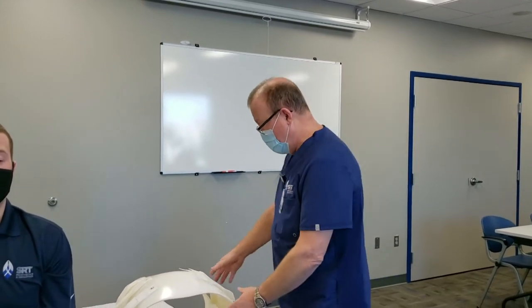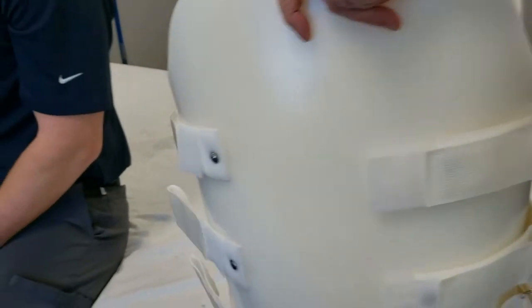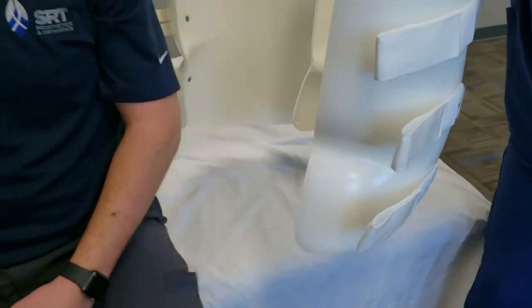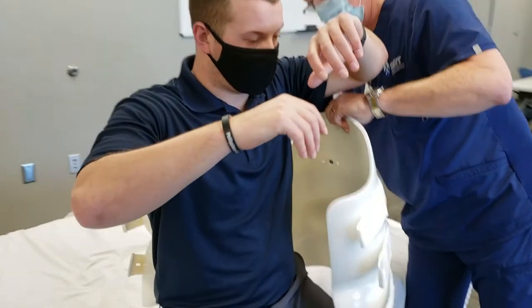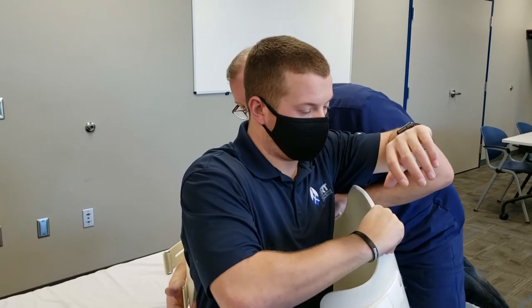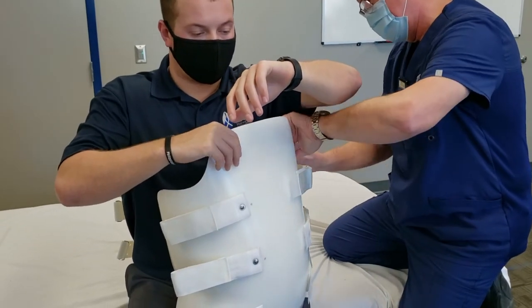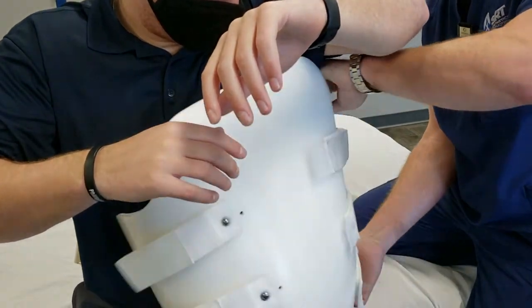Another possible way to don and doff a custom TLSO is seated bedside. This may happen if the patient had a fusion surgery and they're pretty secure with their spinal stability, but we need to protect them during their ADLs. What we would recommend is to leave three straps on one side of the brace fastened, so it can be opened up like a clamshell and brought in from behind the patient. Make sure the waist groove is placed on the hips.